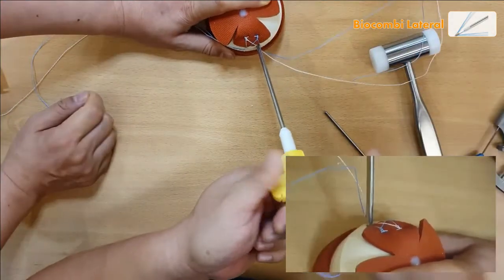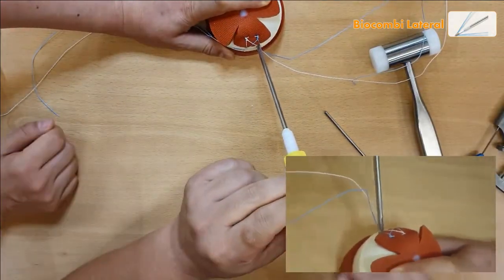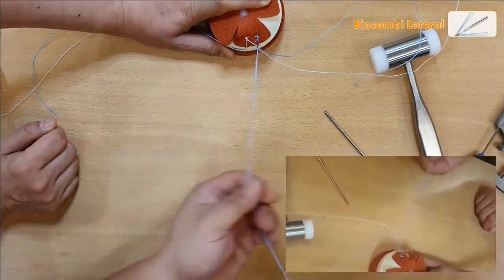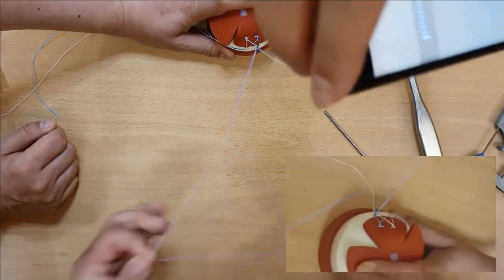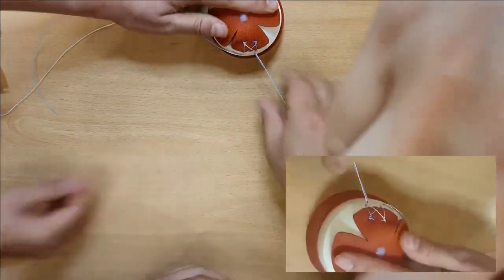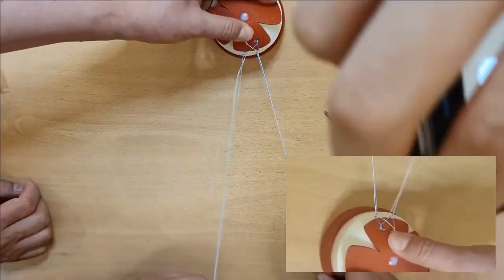Just remove it and remove the extra fiber wires on the top. Now, remove it. It's all done. No unwanted tension and no twisting of the fiber wires.